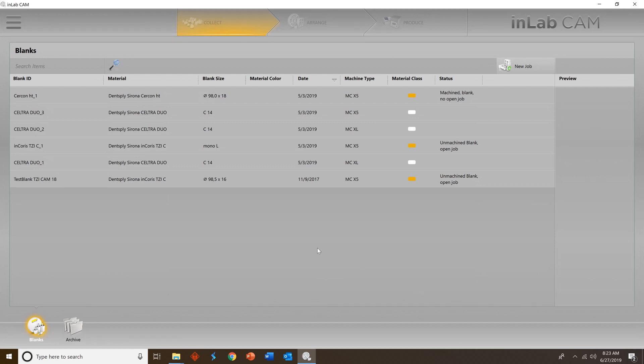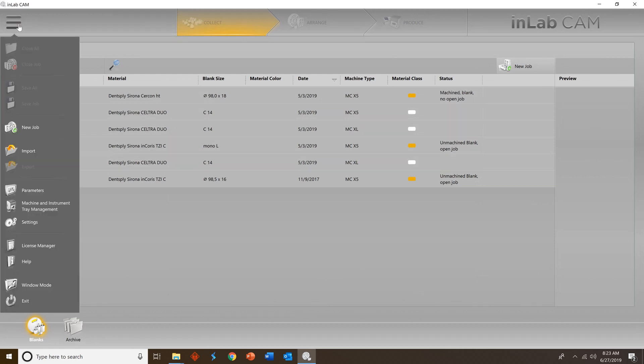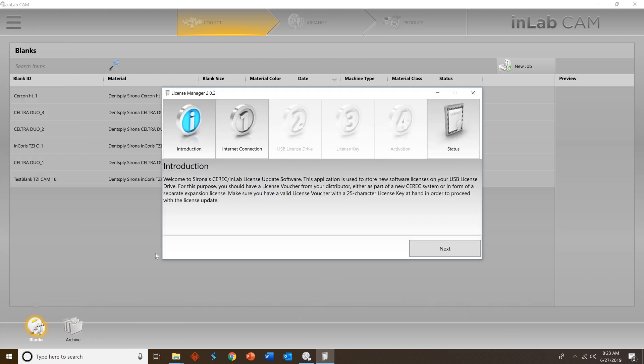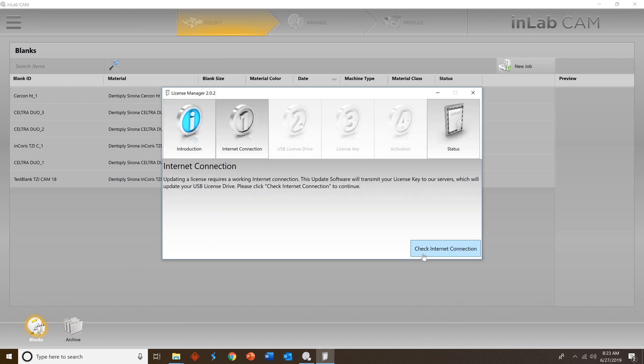Once you've done that, go ahead and go up to the menu in the top left corner, go to license manager and we'll start the license manager process. You'll see an introduction slide. Go ahead and press next and then we'll check our internet connection. Select checked internet connection.